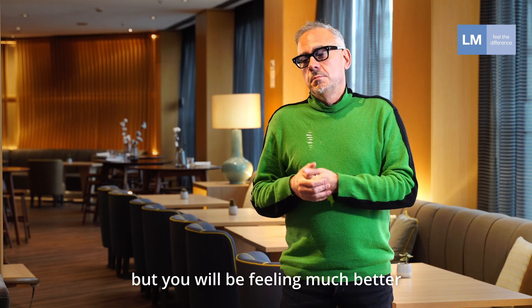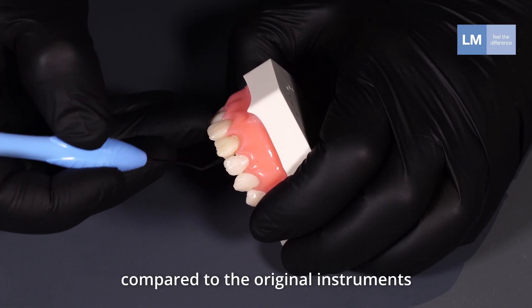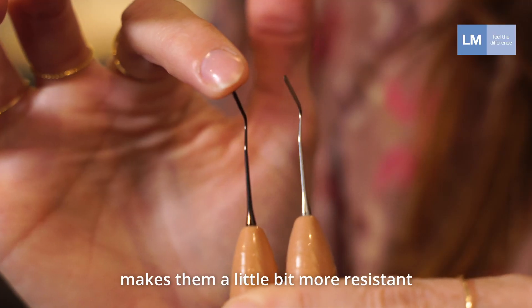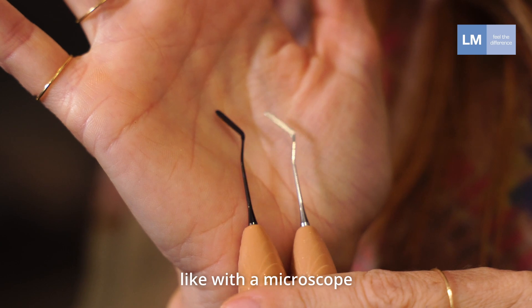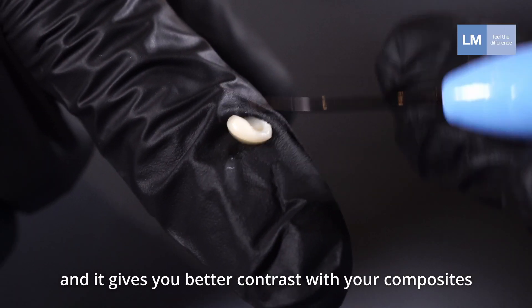You will feel much better with this dark surface rather than the original one. This black coating makes them a little bit more resistant, with no reflections from light sources like a microscope or unit light, and better contrast with your composite.